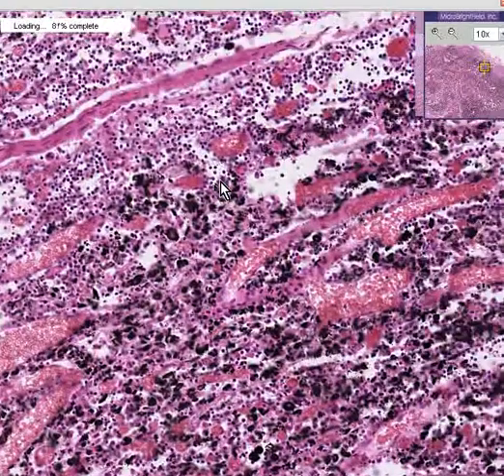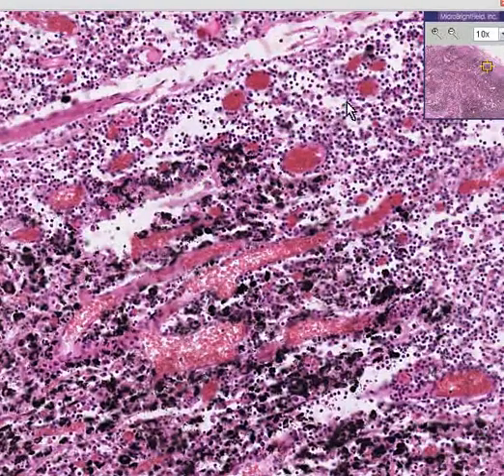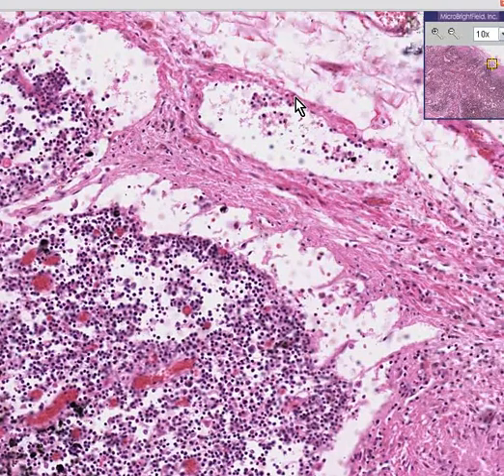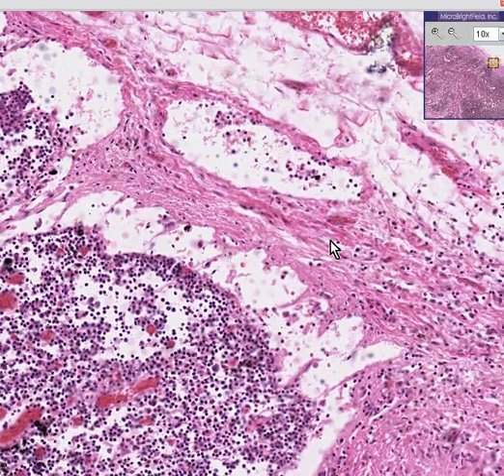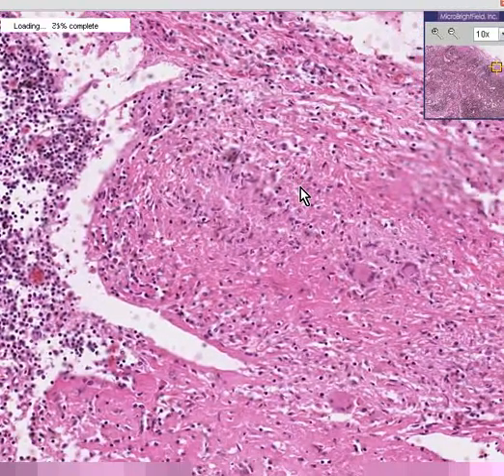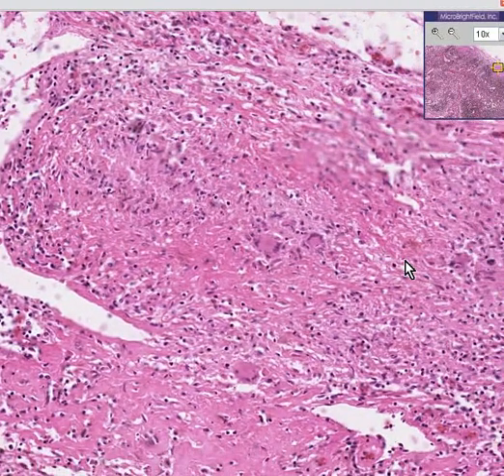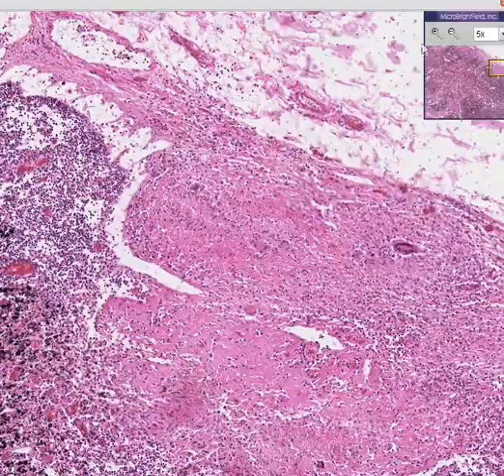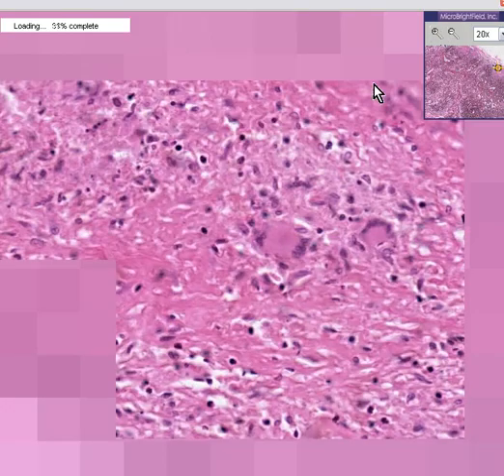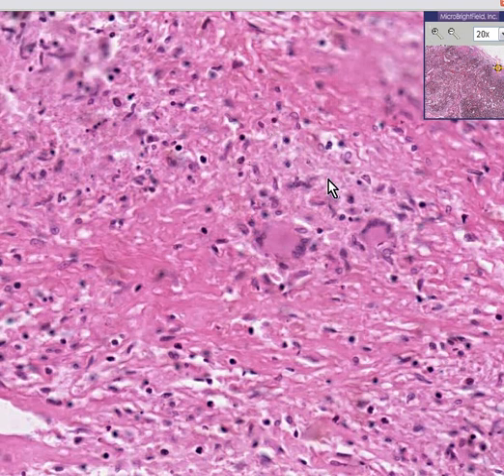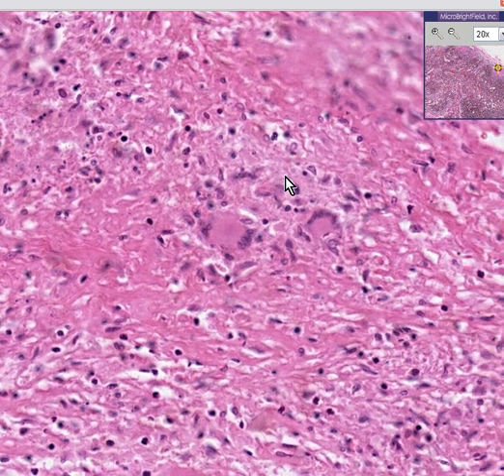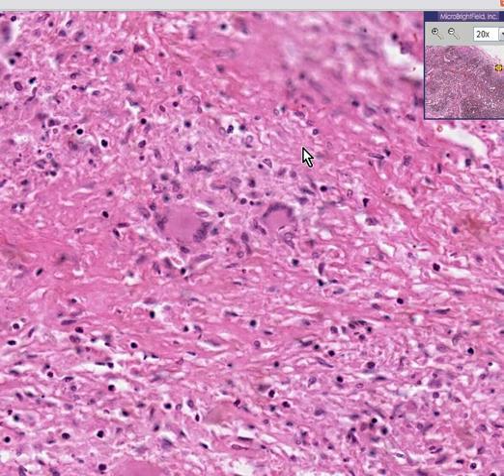In addition to these soot carbon anthracotic particles, you can see the capsule of the lymph node, the subcapsular sinus, and these little nodules — granuloma-like structures. They are granulomas, and in addition they have a granularity to them which suggests necrosis — and they are necrotic. If you were to cut through this grossly you might think it looks like cheese. This is caseous necrosis in granulomas within a lymph node.